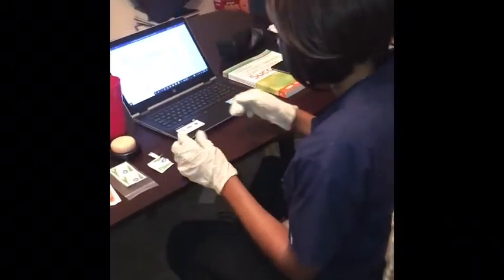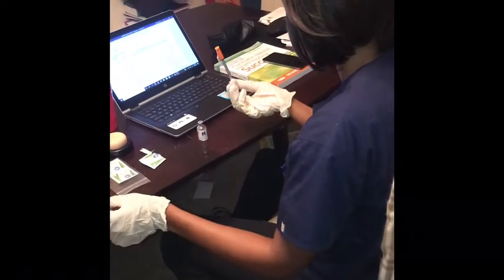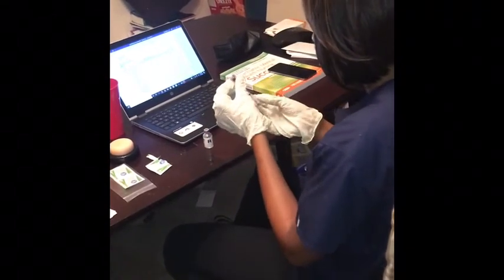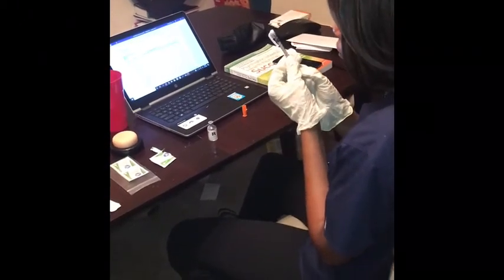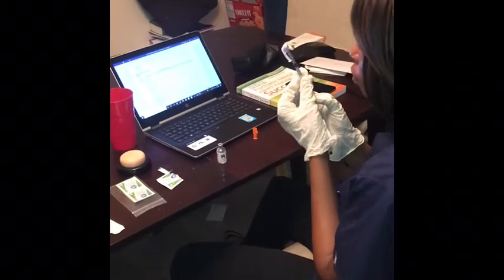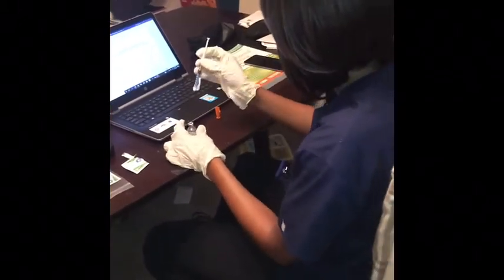Toss that away. And then take the cap off the needle. I'm going to put air in the syringe, 58 units of air. All right, there you go. And then I'm going to inject it into the vial.